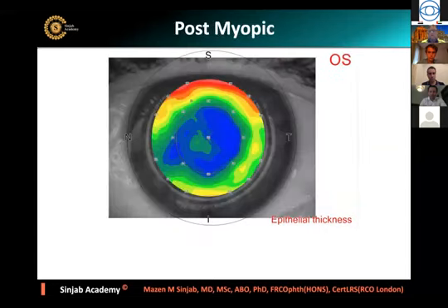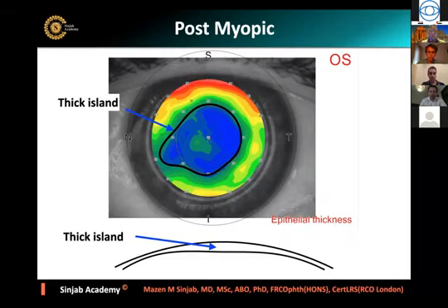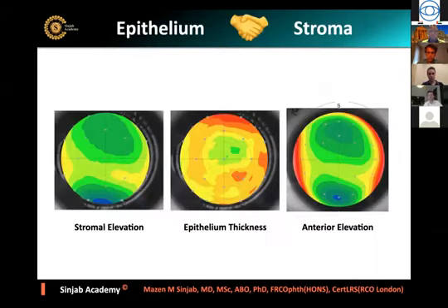This is a case of post-myopia, because after myopic ablation, especially if the zone was very small, as Shadi mentioned before, the epithelium will thicken, and this will cause loss of effect. In addition, we can see the same in the hyperopic treatment, where the ablation is peripheral and the epithelium fills the gutter or the ablation zone and causes loss of effect.